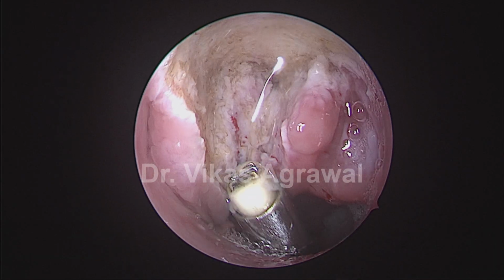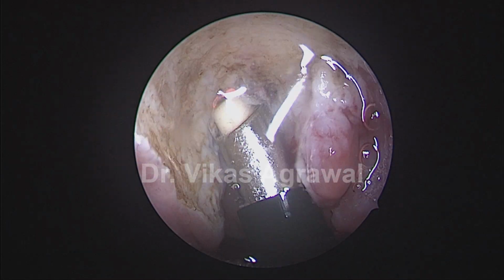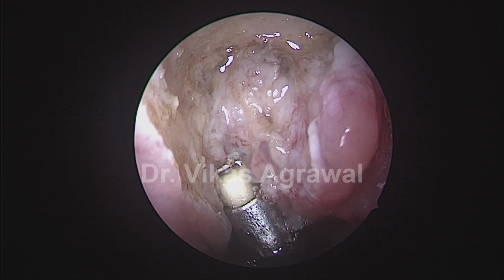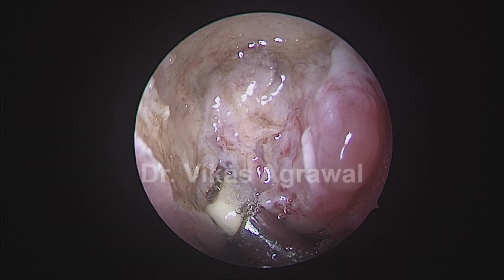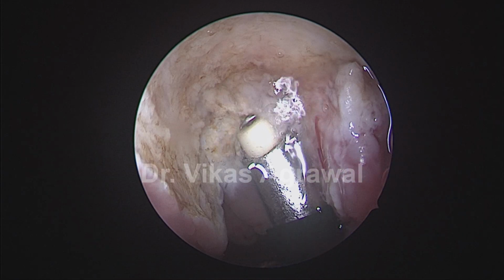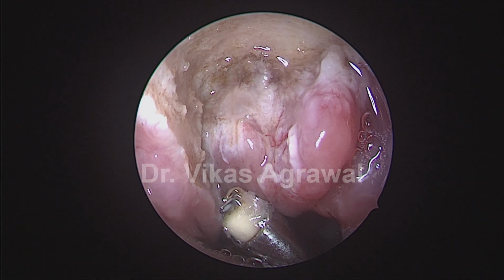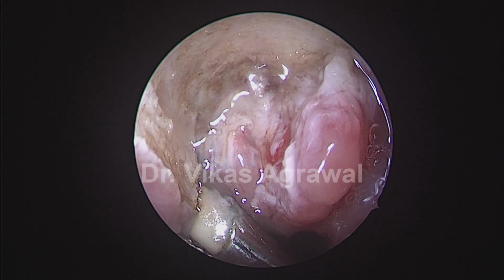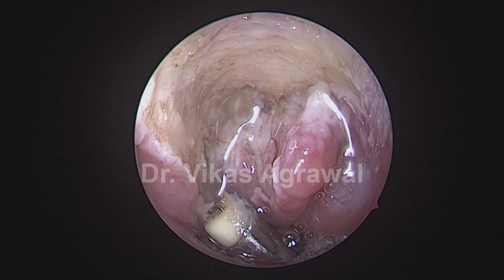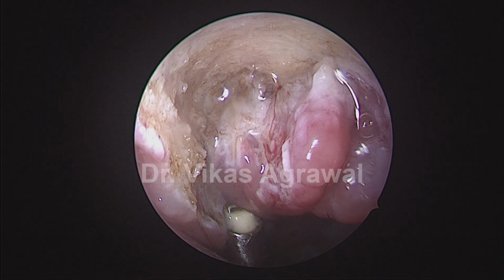You can see I have ablated the superficial tissues. Now I am getting into the fossa of Rosenmuller. So complete removal of tissues from the fossa of Rosenmuller is important so that there is no recurrence. That is our lateral boundary posteriorly. This is the lateral boundary anteriorly.